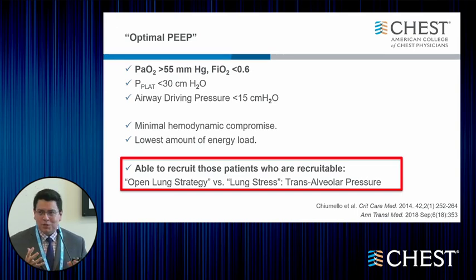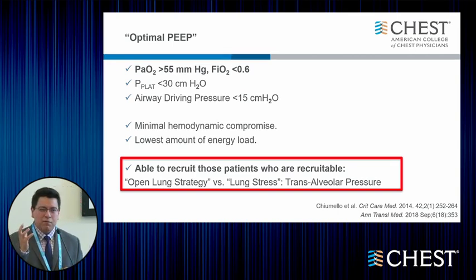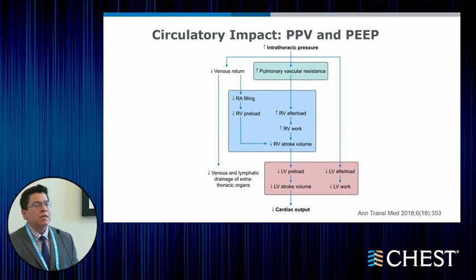So also it's important to know that the best PEEP is the PEEP that we apply to those patients that are going to respond to it, meaning patients that are recruitable, right? So keeping lung recruitability in mind is very important.